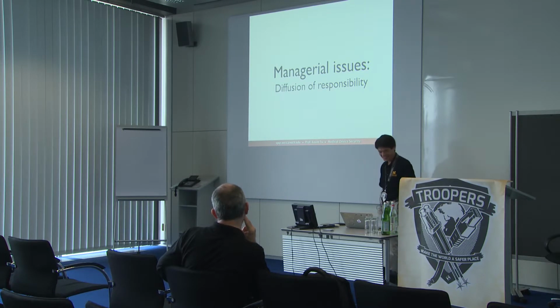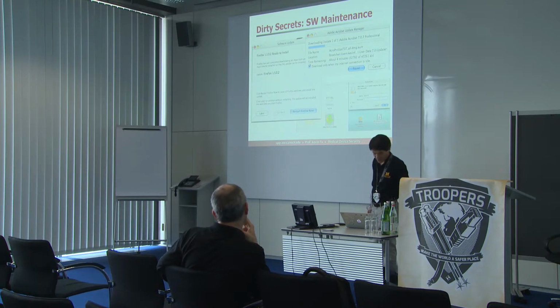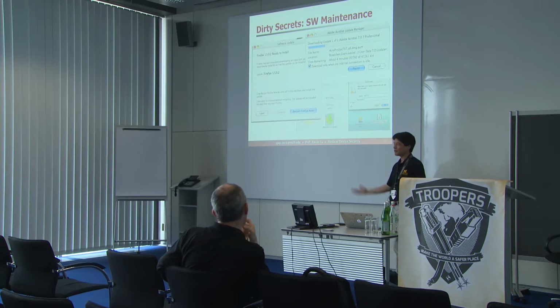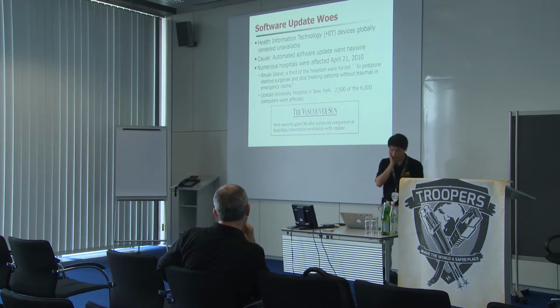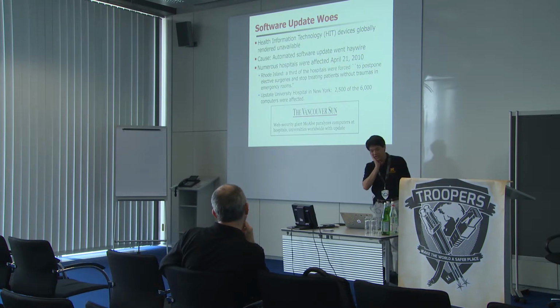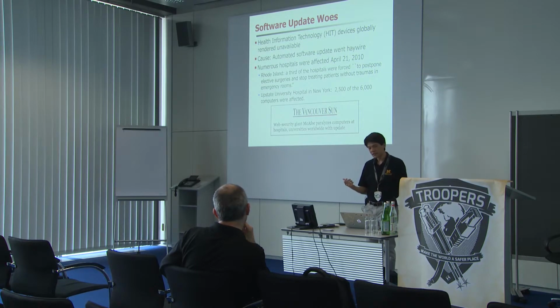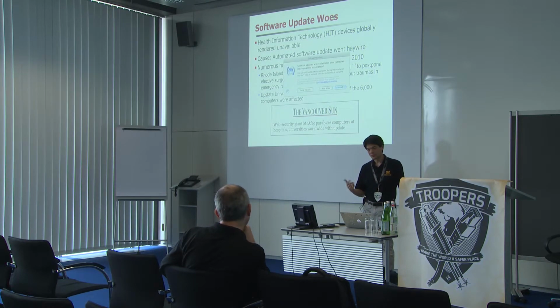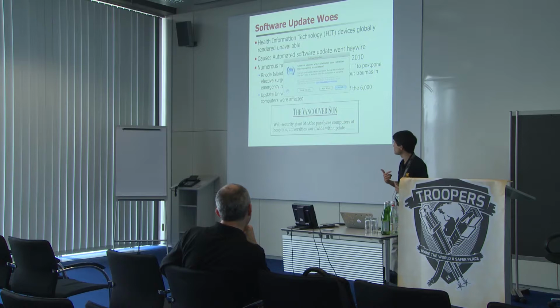Okay, good. I used to collect all these little dialog boxes whenever I'd get a little software update on my computer. Nowadays it just happens. Nobody even tells me, I guess. But this happens on medical devices too. You might recall a few years ago, there was a problem with a McAfee software update where the McAfee antivirus program accidentally misclassified a critical Windows DLL as malicious and then quarantined it. After they quarantined this, it went into the blue screen of death. It would just constantly lock up and have to reboot every time.